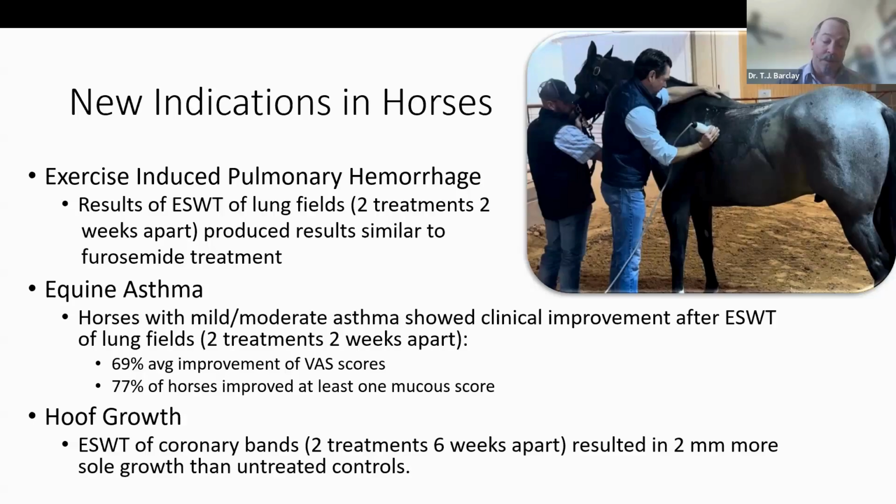Those were some very promising results, and also coming from that study, 90 plus percent of those horses either completely quit coughing or improved enough that they could go back to competition. There's some work that's actually still ongoing relative to shockwave and equine asthma, but that is a very promising indication for shockwave that's pretty new.